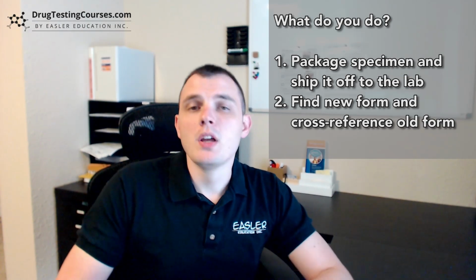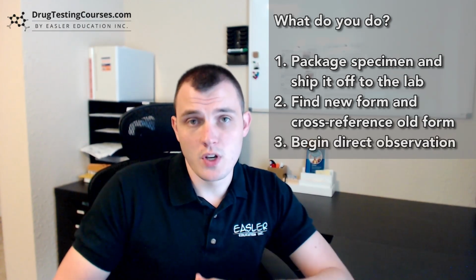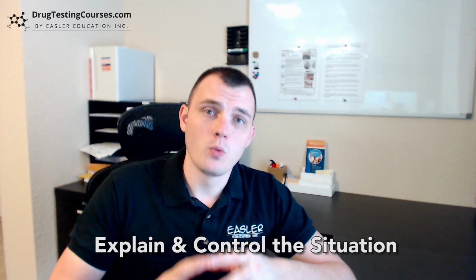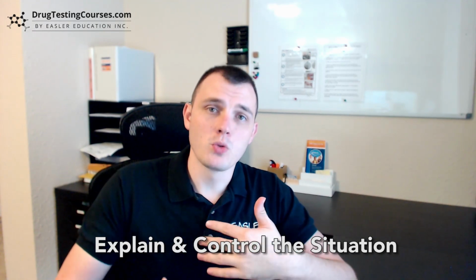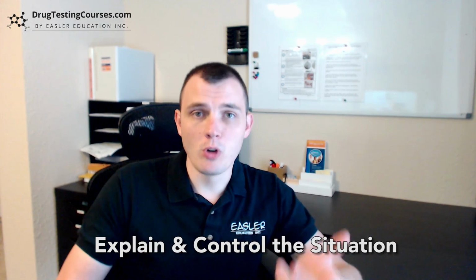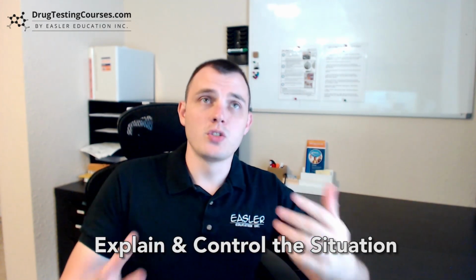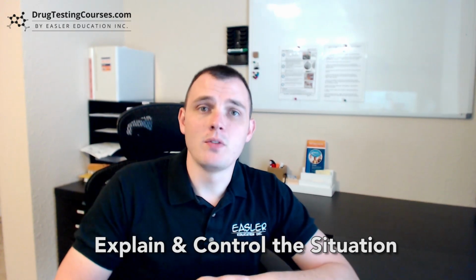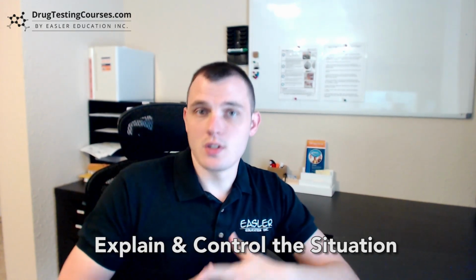Next thing we're going to do is get out our new form and cross-reference the original form and then begin our direct observation procedures. When we do this, we need to explain to the donor what's going to happen, but we also need to make sure that we're controlling the situation, because we don't want this donor to blow up on us, or to get extremely defensive, which can certainly happen if you start making accusations that they've somehow adulterated the specimen.